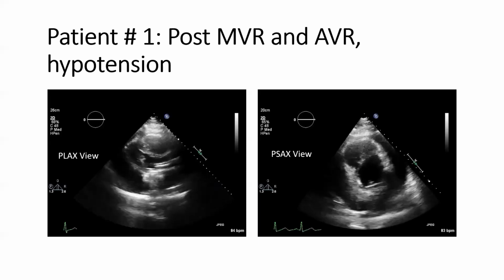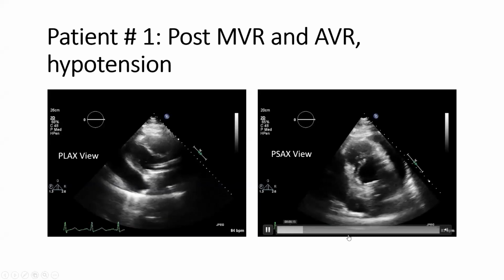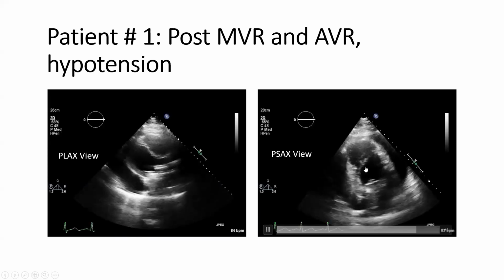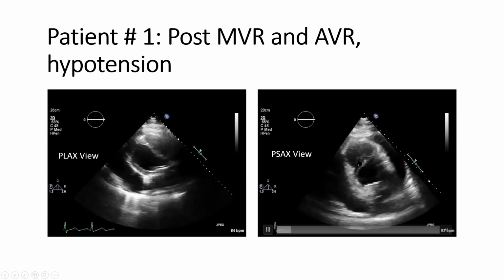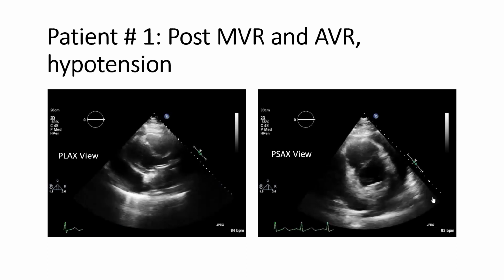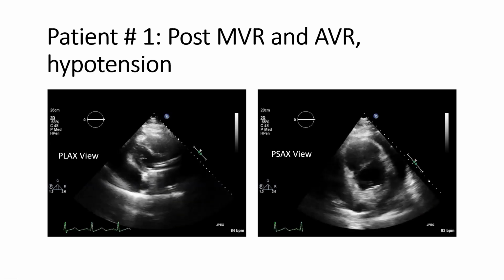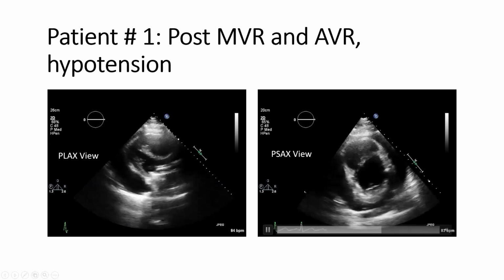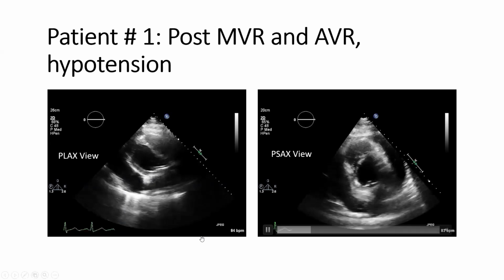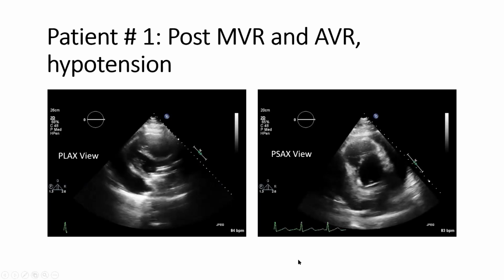Now, the real challenge in actual practice, and I don't think this is an exam helpful point, is that most of our clips are acquired with 3 or 4 beats. So it is very easy, depending on luck of the draw, that the clip did not include enough beats for you to decide on any abnormal motion of the septum related to respiration. So I always tell my sonographers that you get to see a lot more than we, the physicians, get to see at the time of reading. So this requires an astute interaction between the scanner and the image in real time. So this is one example of ventricular interdependence that you may be able to see on the echo.